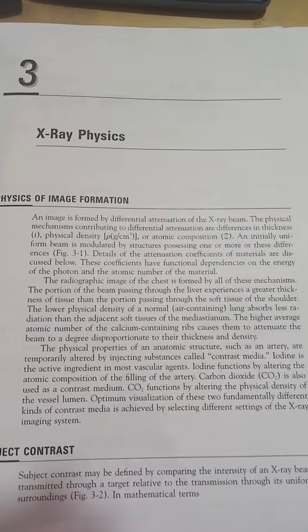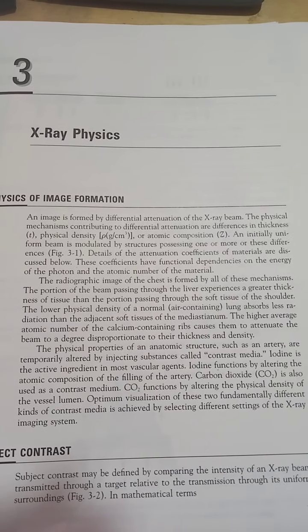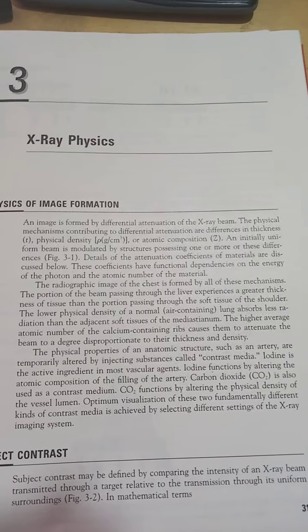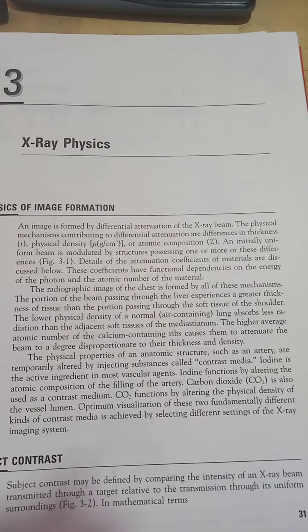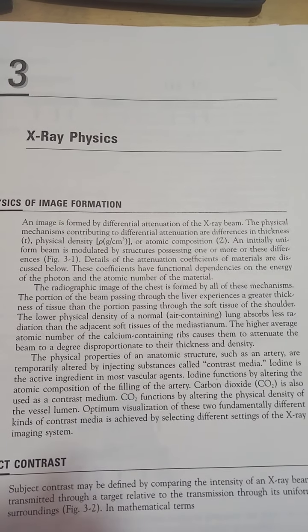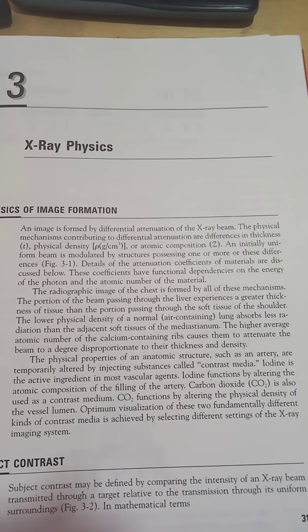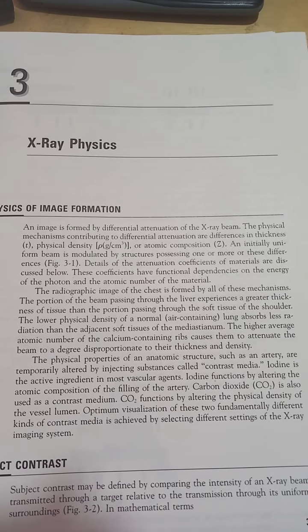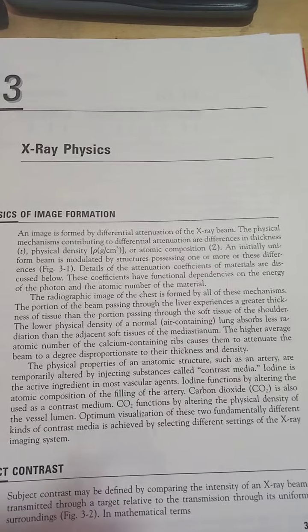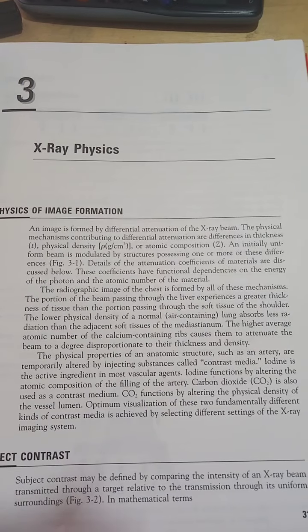Right, so I'll be talking about X-ray physics and the physics of image formation. An image is formed by differential attenuation of the X-ray beam. The physical mechanisms contributing to differential attenuation are differences in thickness, density, and atomic composition, like elemental differentiation. Initially, a uniform beam is modulated by structures possessing one or more of these differences. Details of the attenuation coefficients of materials are mentioned, and these coefficients have functional dependencies on the energy of the photon and the atomic number of the material.